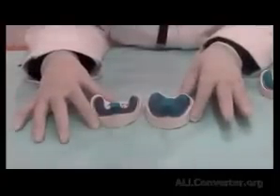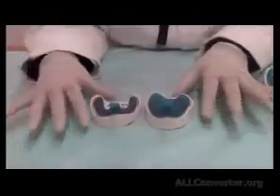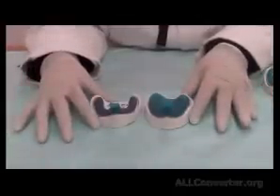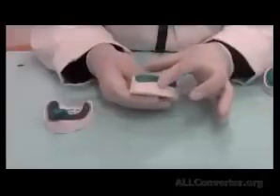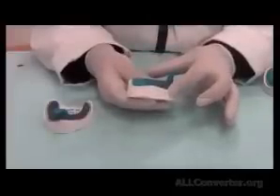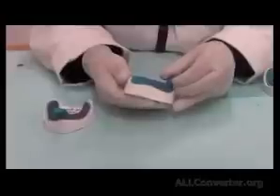checked inside the mouth. For this demonstration, we don't have the patient here, but what we usually do is that we check that the features that are present on the cast are also present inside the patient's mouth. Remember that we took a primary impression. That means in some areas we have not fully recorded the details of the basal seat area, and we need to take something more accurate. So we said that we need what we call a secondary impression.